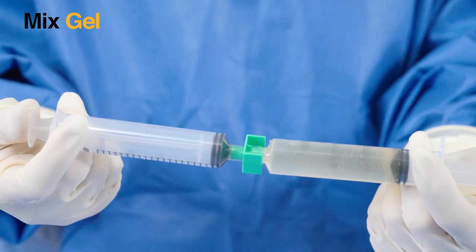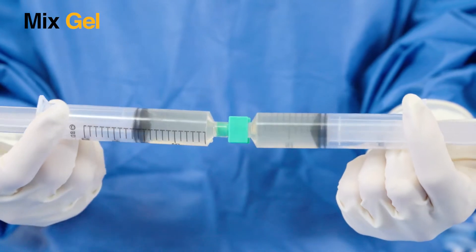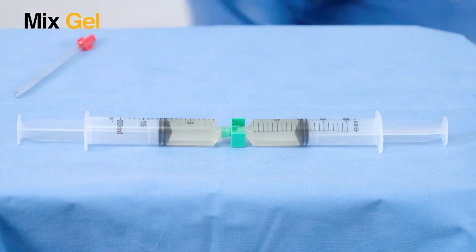Approximately 5 minutes before gel application, mix the two syringes by fully pushing the contents of each syringe into the other at least 6 times. Then divide the gel into equal portions.